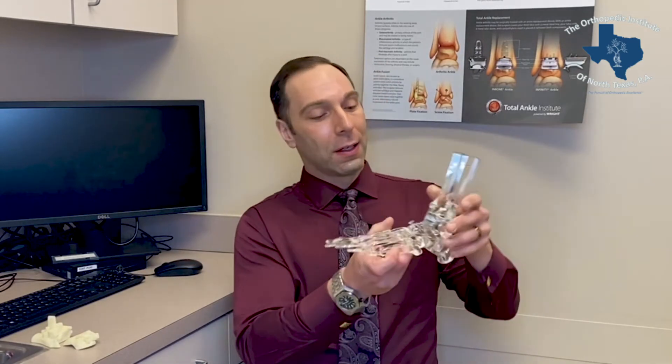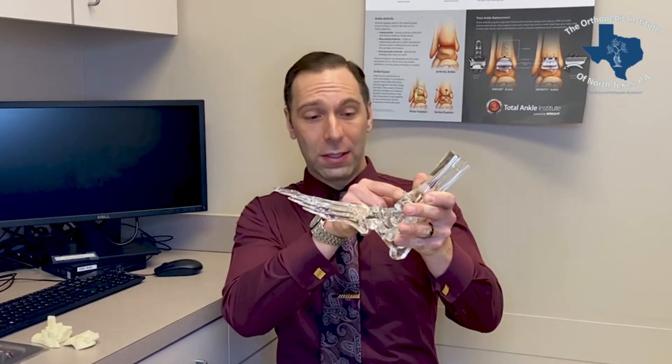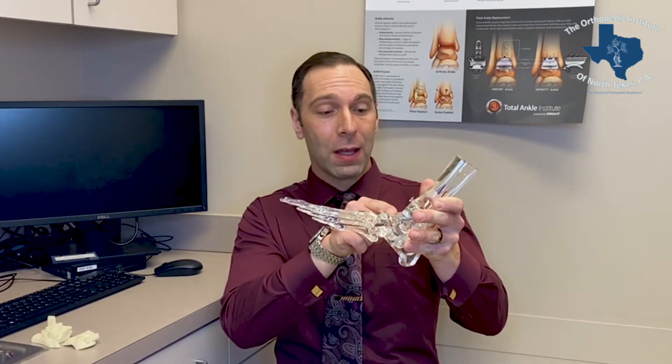The total ankle replacement involves making cuts along the tibia and the talus, and these cuts, if placed in the wrong position, can lead to early implant failure.